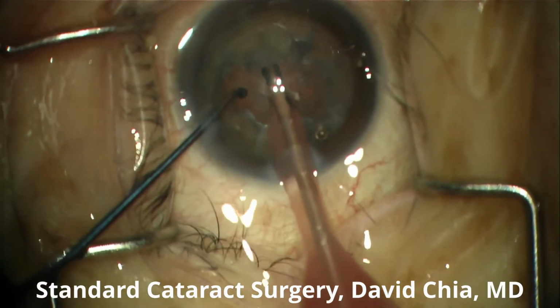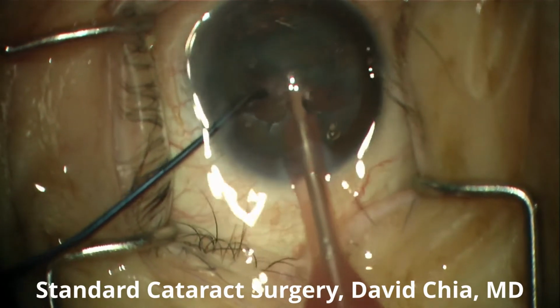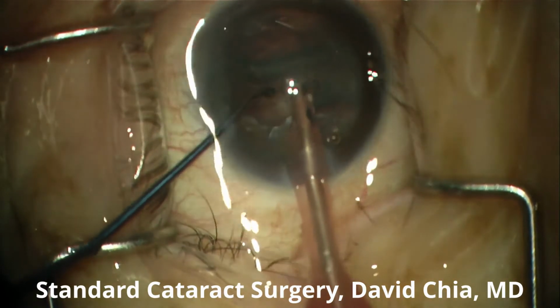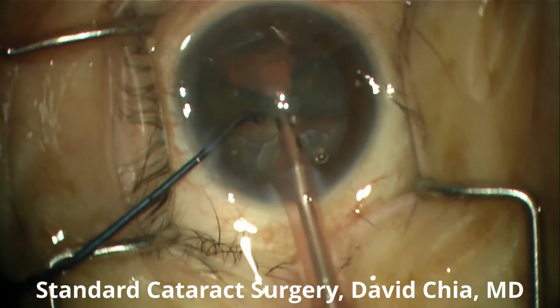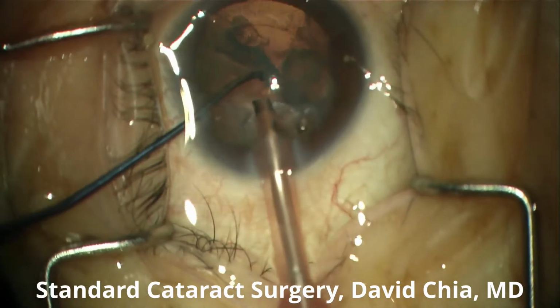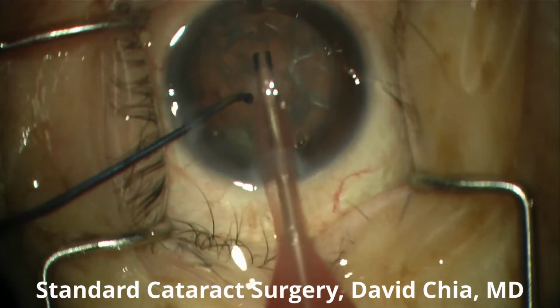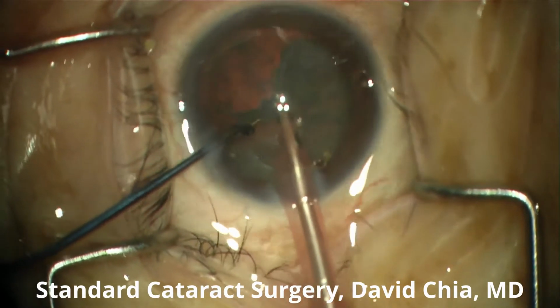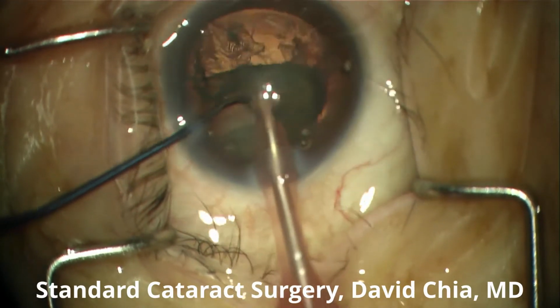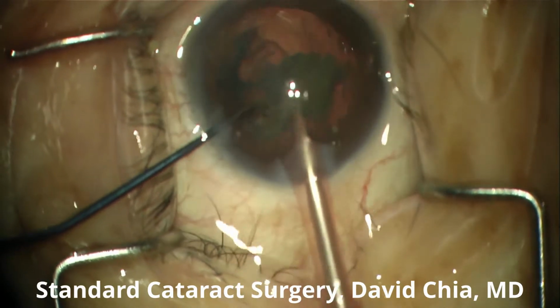We have removed the endonucleus, and now we're preparing to remove the epinucleus. This epinuclear shell provides some protection for the capsular bag, and so we generally like to remove this after the harder endonucleus has been removed. It's important at this time to slow down the procedure because it is really important to maintain the structural integrity of the capsular bag. And so you can see here the epinuclear shell is being teased away and removed slowly and judiciously.